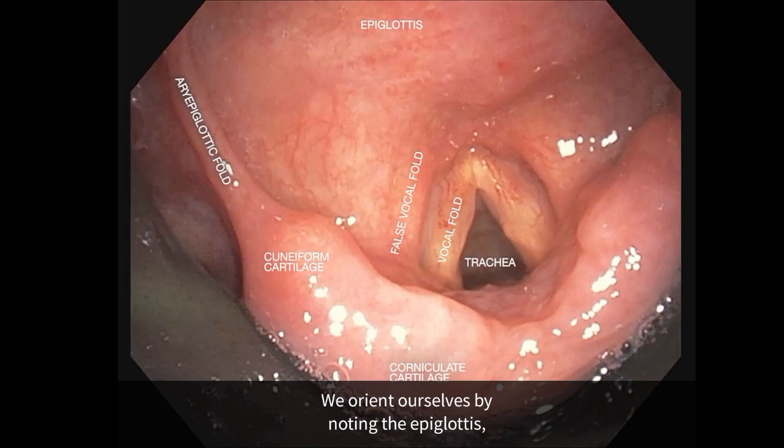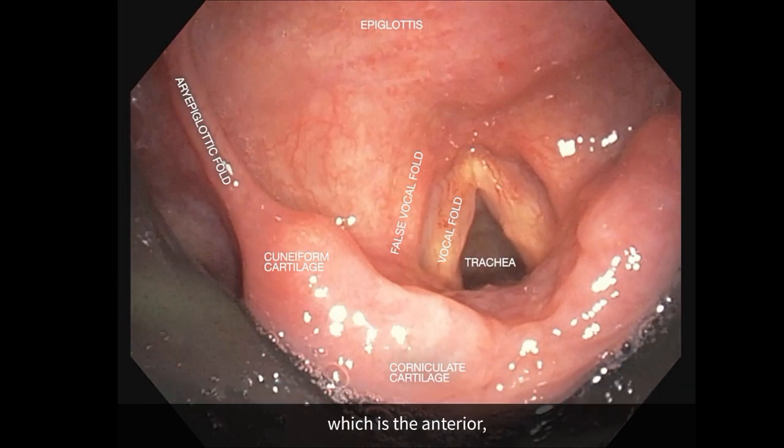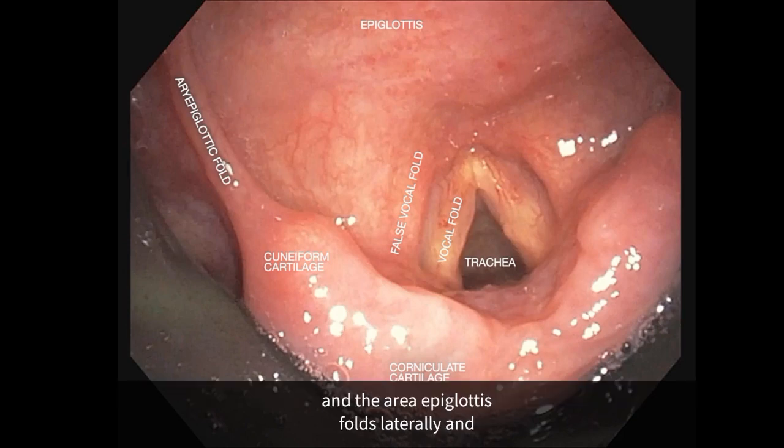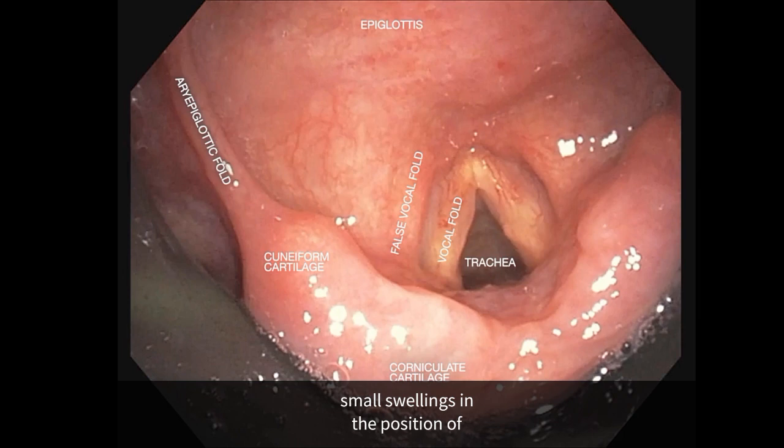We orient ourselves by noting the epiglottis, which is anterior, and the aryepiglottic folds laterally, and small swellings in the position of the cuneiform and corniculate cartilages.